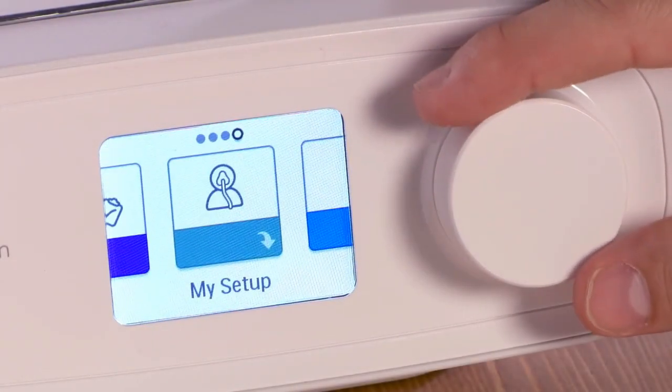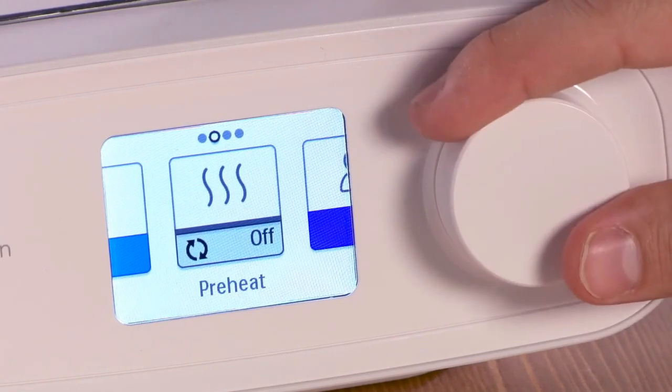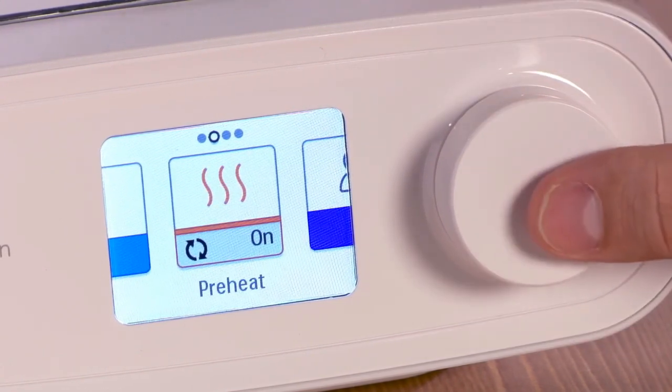This mode is designed to reduce condensation from forming in your tube. A preheat screen allows you to warm up the humidifier water tank for a half hour before therapy. Rotate to on and press the dial.